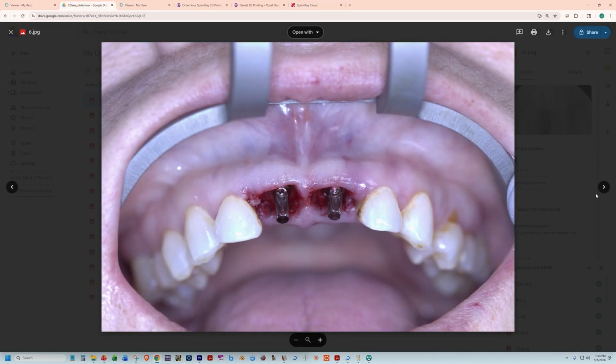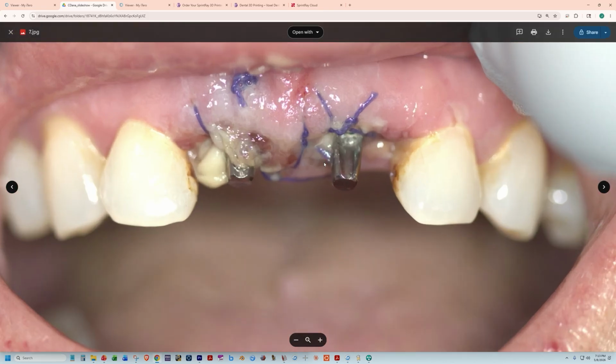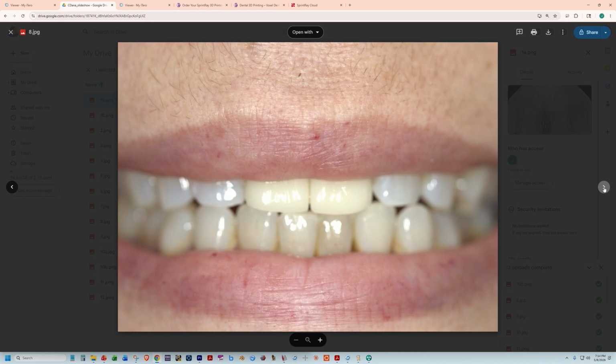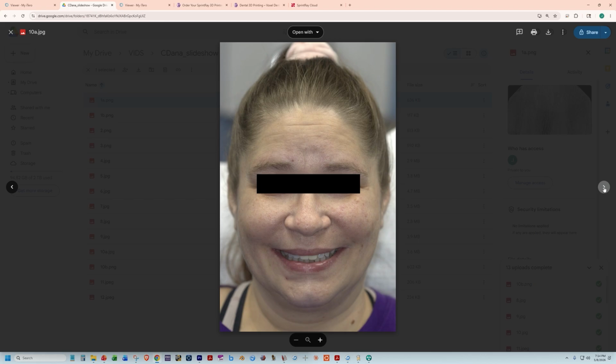And then, so this was the next day, the day after surgery. Notice that shape, that geometry that we talked about a minute ago. That's the same geometry on the inside of the temp crowns that were fabricated. So when she came in, we got her numb on day 2 and put the temp crowns in, and they looked like this, individual units. And she was very, very happy.